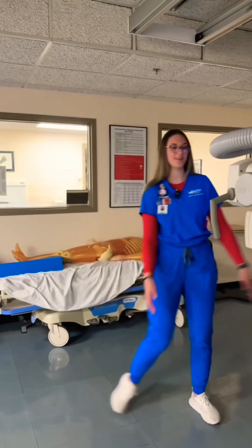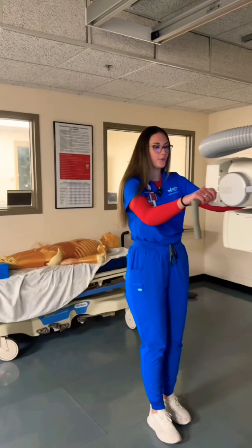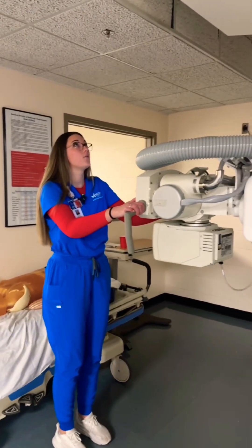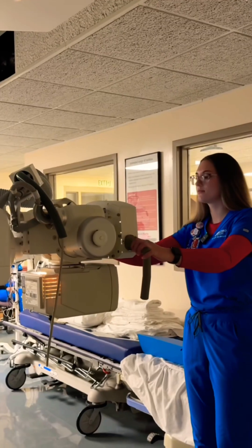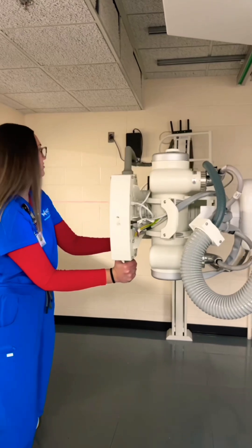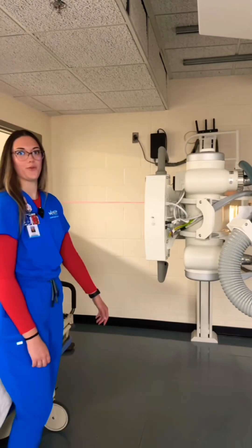So before we grab the patient, we're going to set up our room. We're going to detent our tube to the wall bucky and we're going to set it at 72-inch SID, and just make sure our bucky's lined up on the wall.